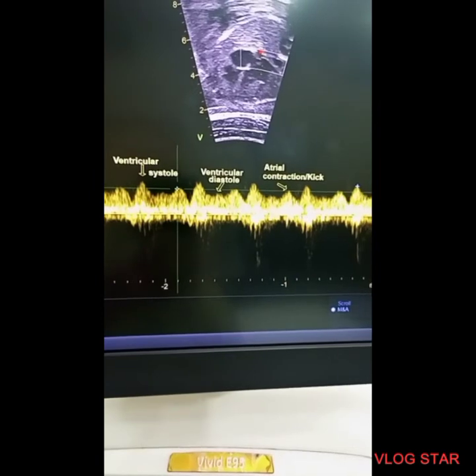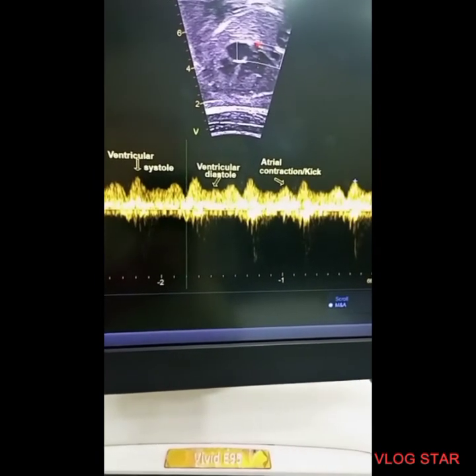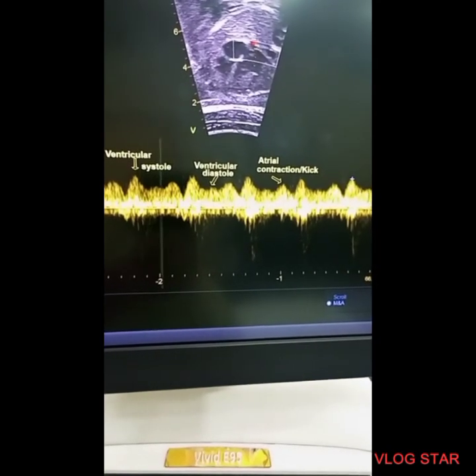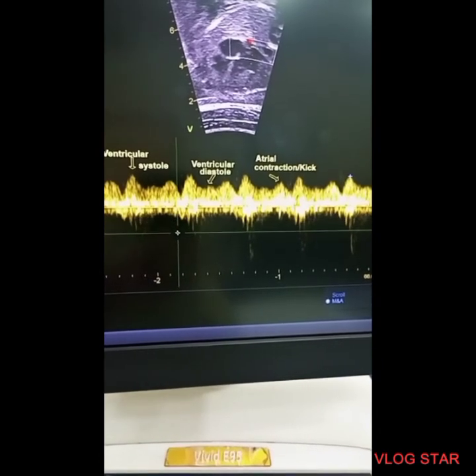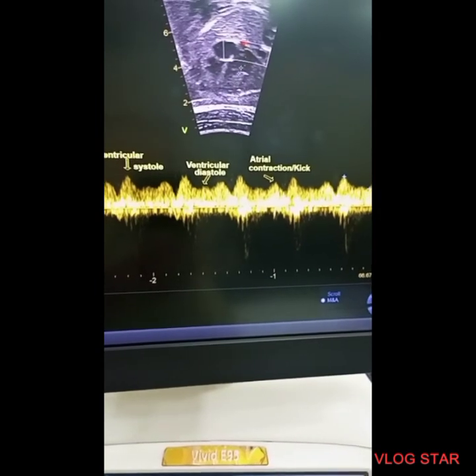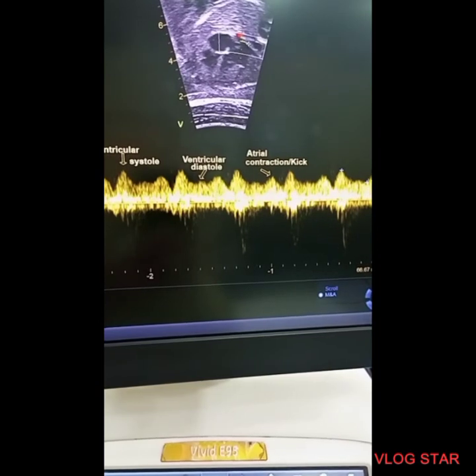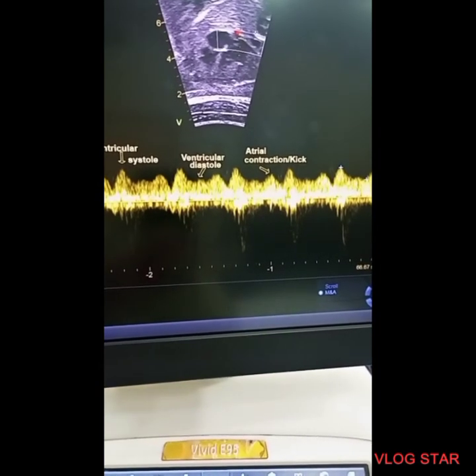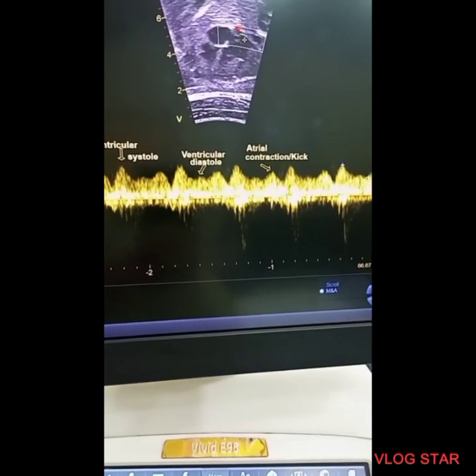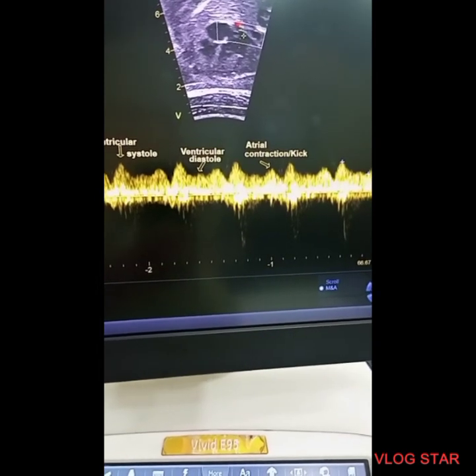Here is the atrial kick or contraction, and then the velocity becomes its lowest, and this pattern may be reversed in case of the hypoplastic heart. We should also see the flow or confluence between the LA and the pulmonary veins. The pulmonary veins and the descending aorta gap should be assessed well on fetal echocardiography in order to exclude anomalous pulmonary venous drainage.